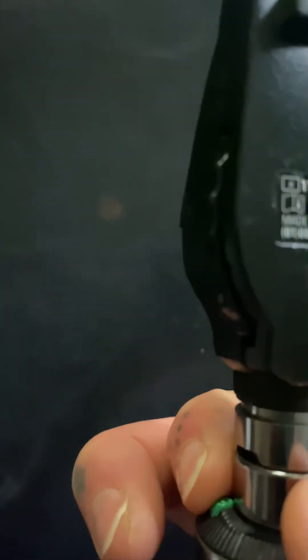For a dog like mine, I think the medium should work. We're going to view her retina in a dark room, which will also help her pupil stay dilated without the use of medication. We can also make sure the rheostat isn't set to the highest intensity — it goes from off up to the highest. This allows the pupil to stay as dilated as possible for a good viewing window, and it's also so that it's comfortable for the patient. Choose a setting comfortable enough that you wouldn't find it distressing yourself — something on the lower intensity.